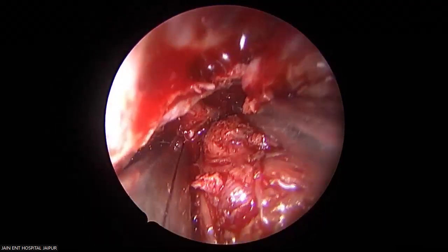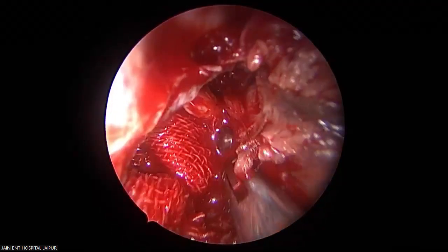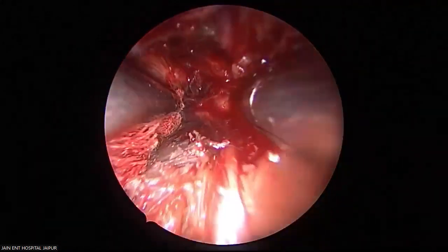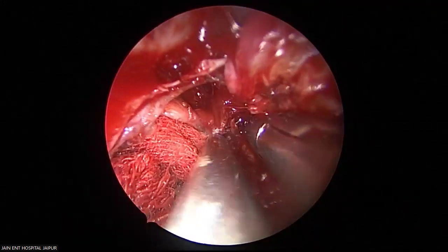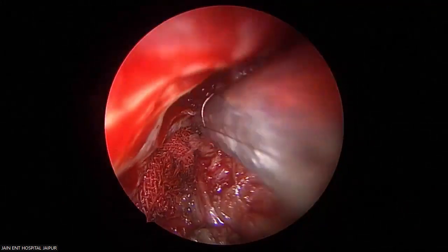That is the infraorbital nerve above. Can you see the infraorbital nerve? See the exposure of the infraorbital nerve above. This is the complete exposure here.